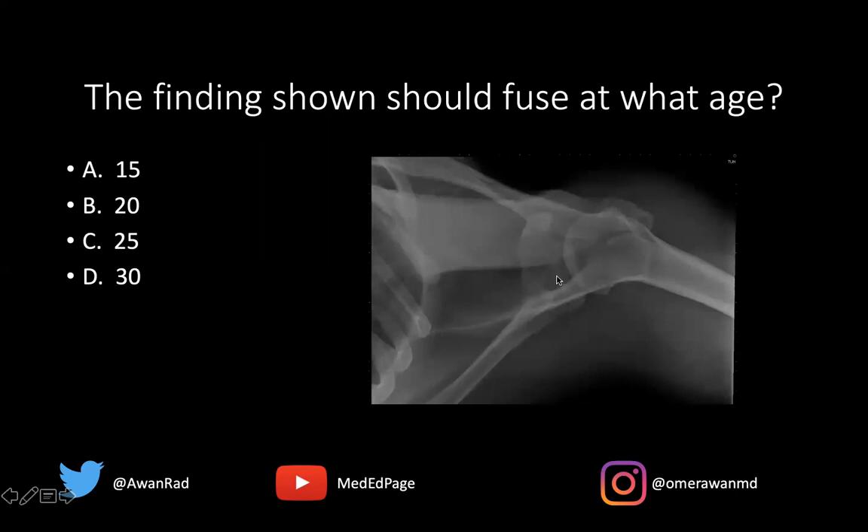This is the glenoid here, this is the humeral head. We can also see the coracoid process here. We can see the distal clavicle articulating with the acromion at the acromioclavicular joint. Notice the acromion is somewhat funny — it's broken into two different pieces. There's a lucent cleft dividing the acromion into an anterior portion and a posterior portion. This should all be one bone, but it looks like the acromion is two bones.